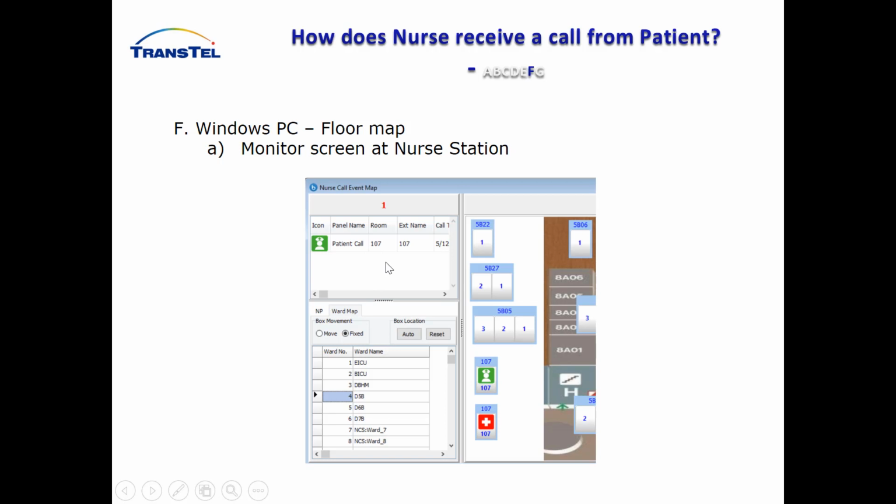And this is also another called the queuing list, to indicate not only the map, but also indicate some other nurse calls you still have. Just like the pop-out screen, we show the previous screen to remind you. There are some nurse calls where nobody has gone there yet to offer the service and then cancel that service.